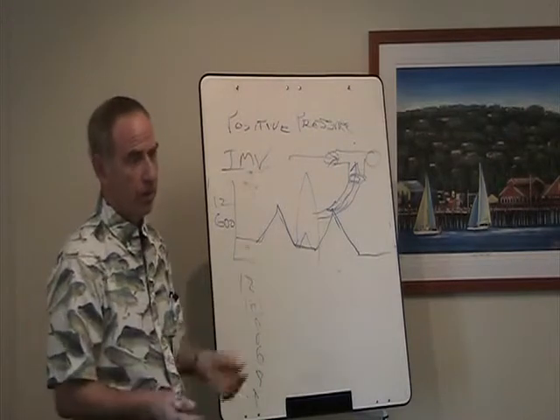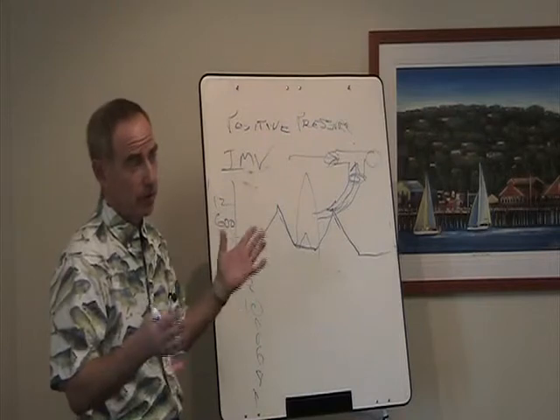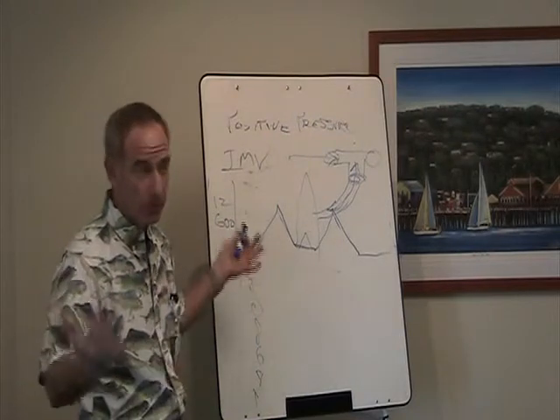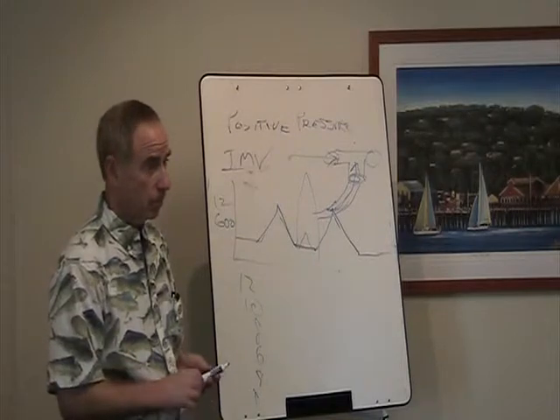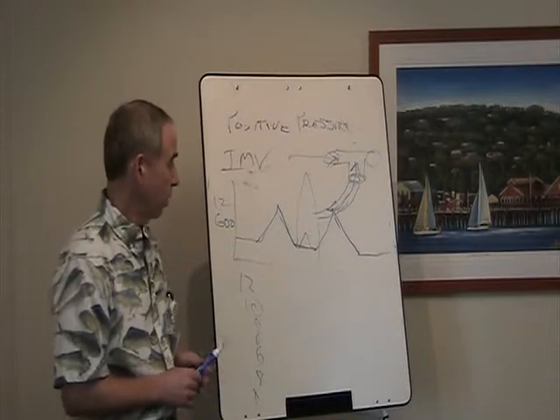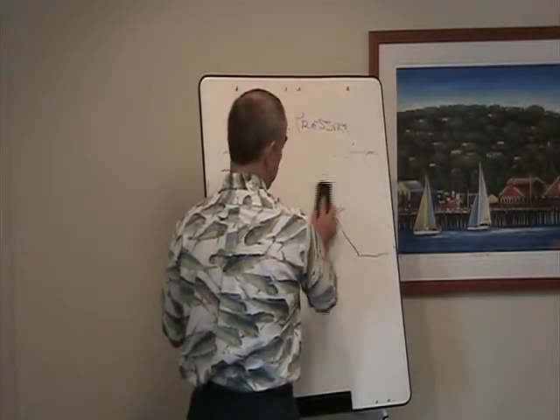Or you would just start them on IMV to begin with. Not even bother with the assist control. You would fully support them in the beginning with enough breaths so they weren't doing much work, and then you would wean them.